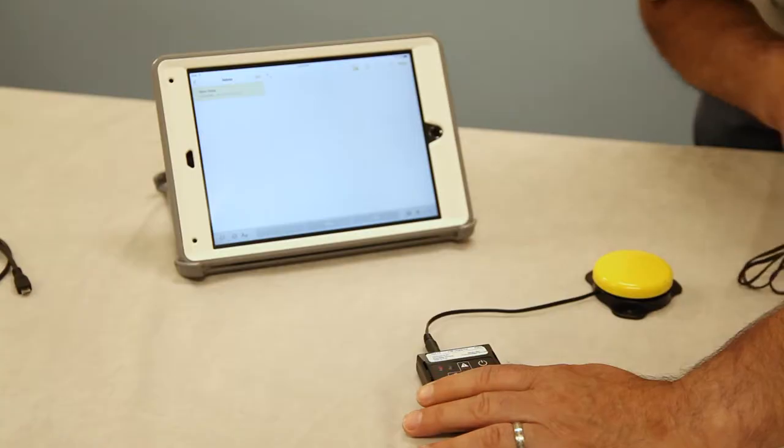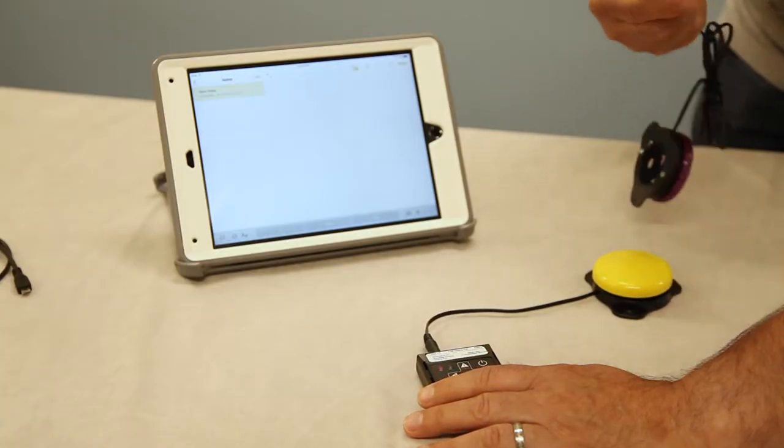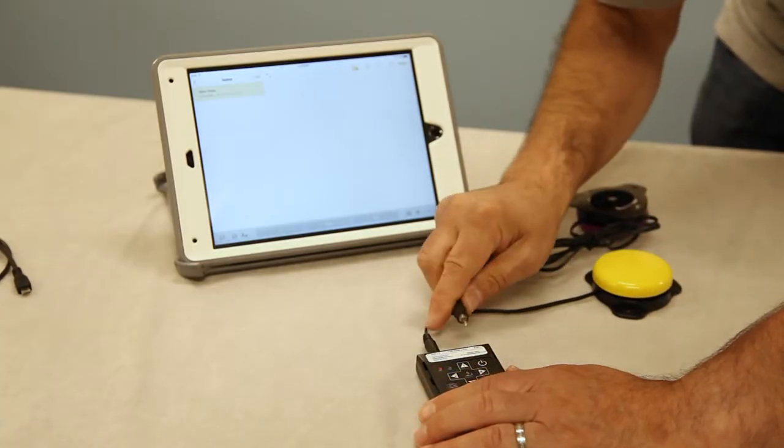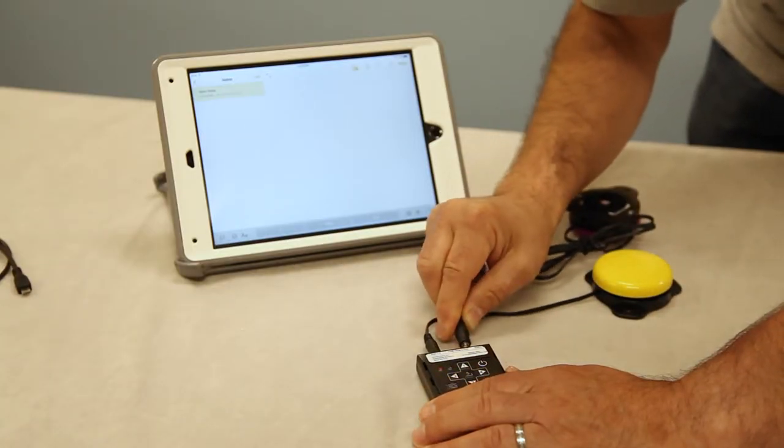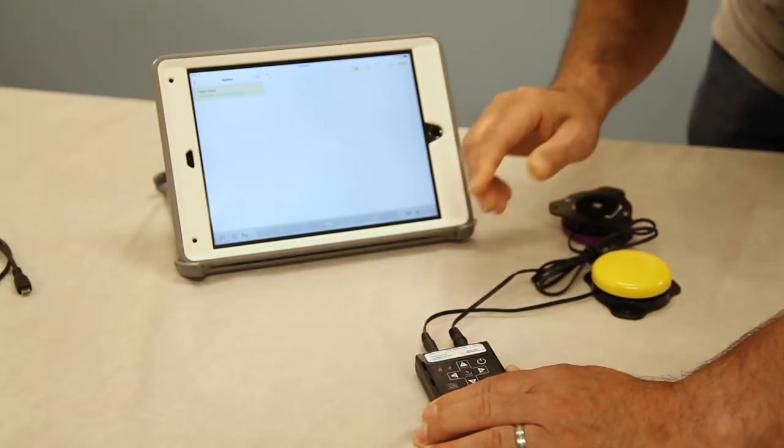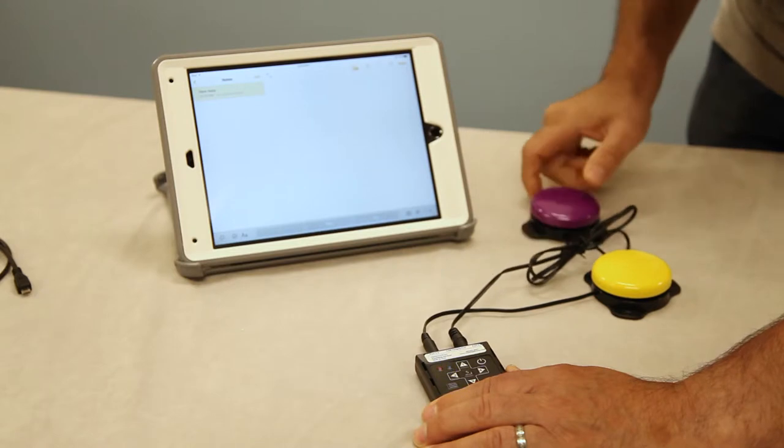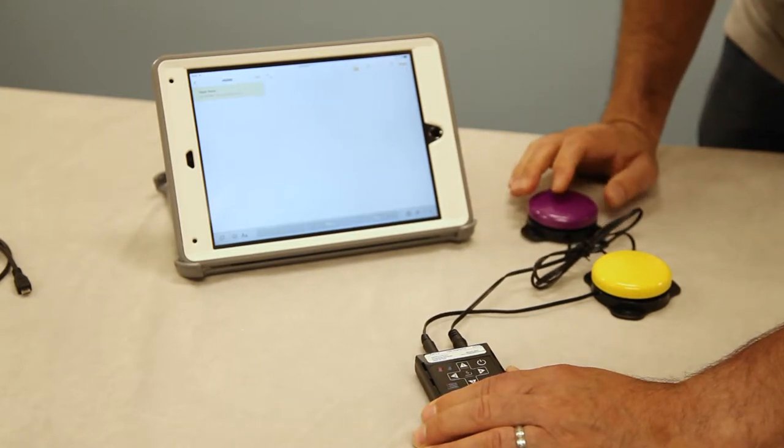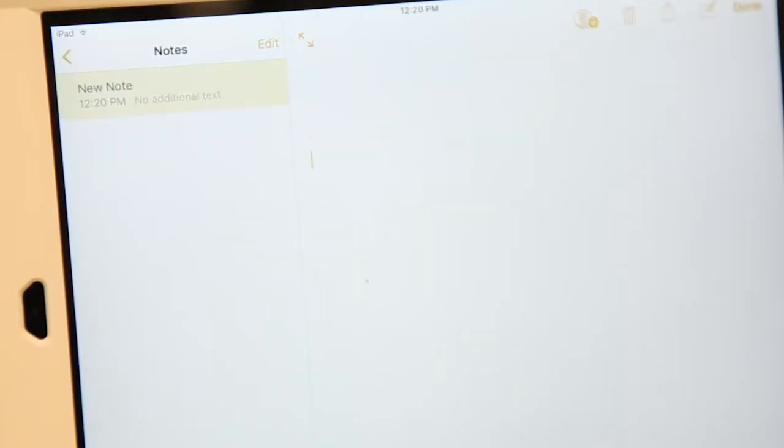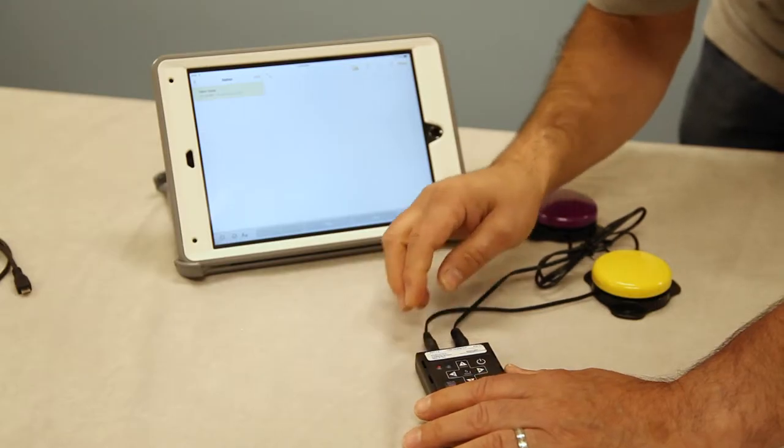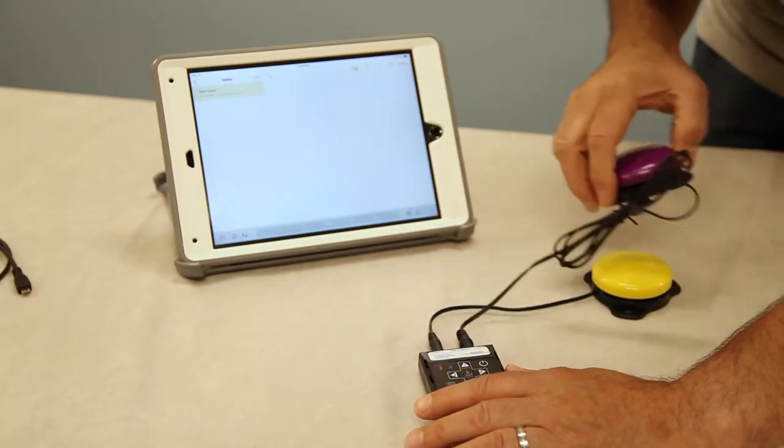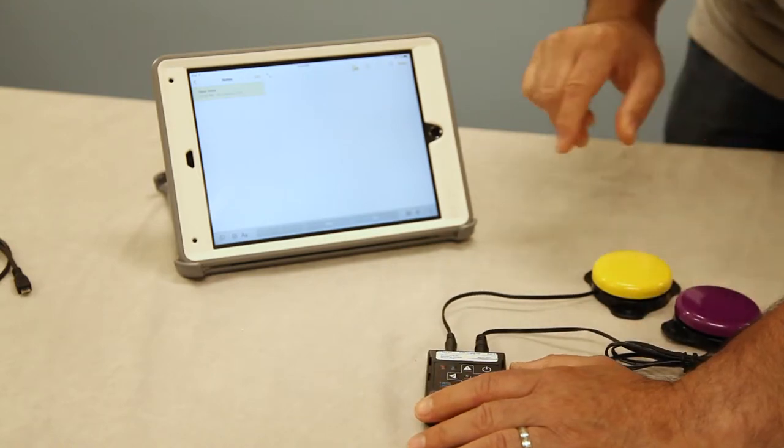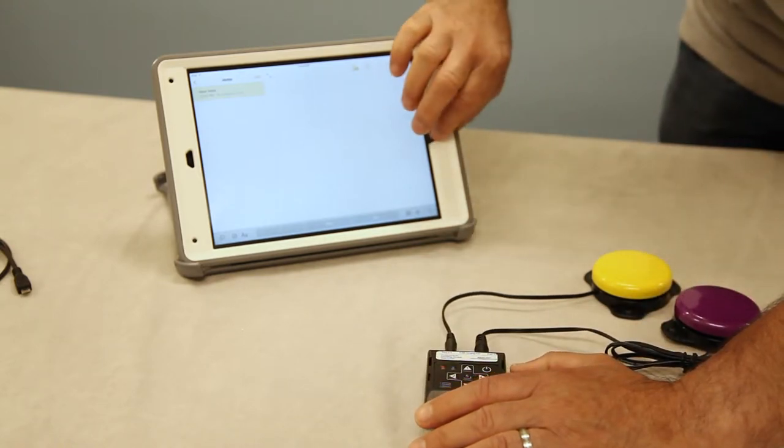And then if you plug a second switch into the port 3-4, that is going to replicate as if you were hitting the enter key. So the cursor is going to drop down the page. So we know we're perfectly set up here for that. And we can close this out.